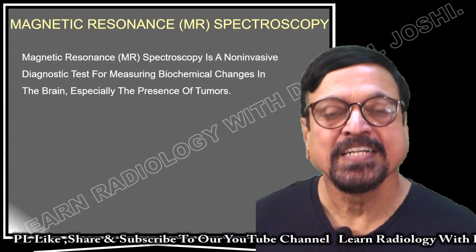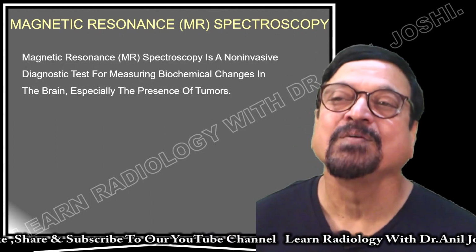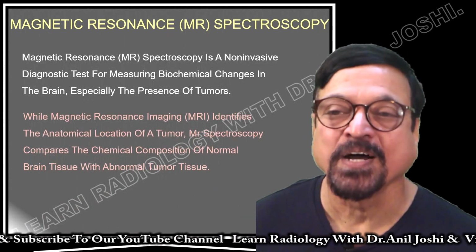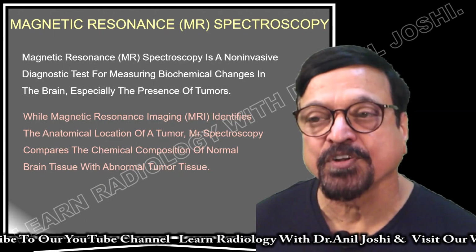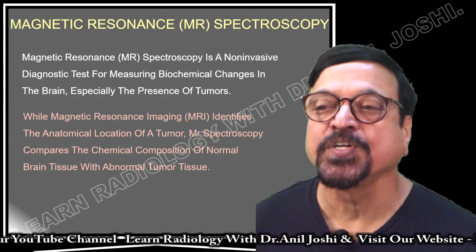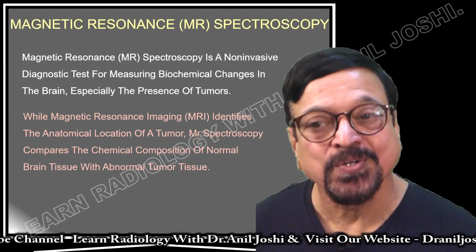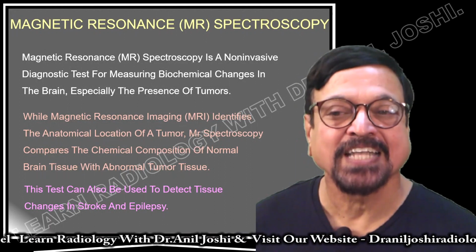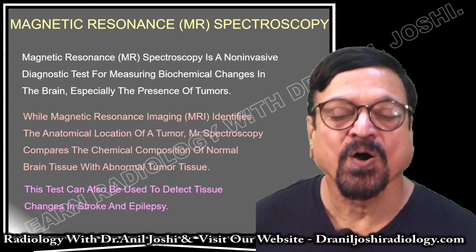So, it will have different type of metabolites, and if MRI can pick these metabolites, we can get idea about what that lesion is, especially when it is a tumor. While magnetic resonance imaging identifies the anatomical location of a tumor, MR spectroscopy compares the chemical constitution of a normal brain with tumor tissues to know what these lesions are, what the pathologies are. This can also be used for detecting changes in stroke or in epilepsy.